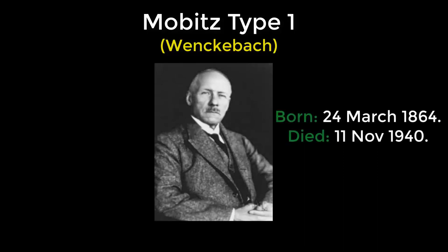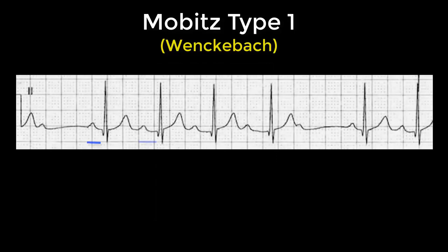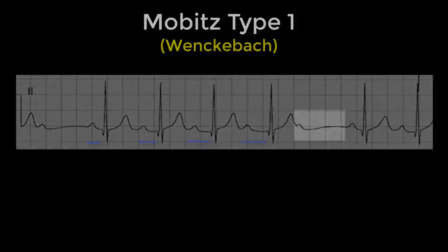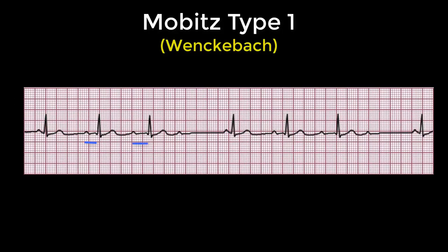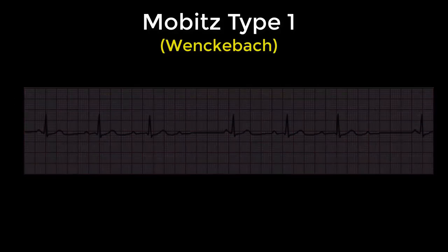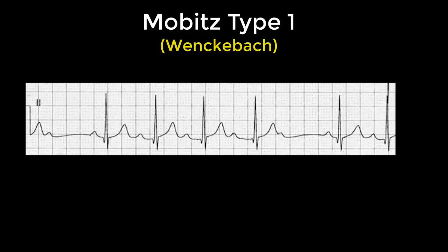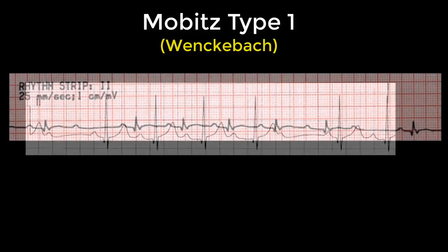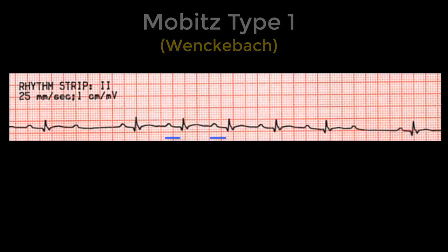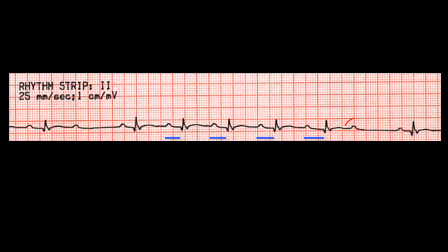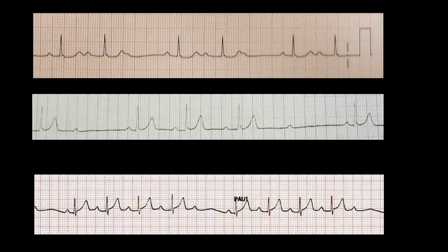In Wenckebach, the PR interval gradually prolongs until the point where the P wave doesn't initiate a QRS complex. Look here: stretch, stretch, non-conducted P. Again: stretch, stretch, non-conducted P. You might get stretch, stretch, stretch, non-conducted P — as we can see here — or even stretch, stretch, stretch, stretch, stretch, non-conducted P. All are Mobitz type one, also known as Wenckebach.